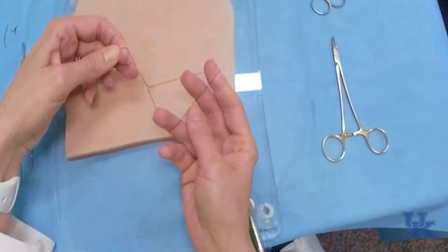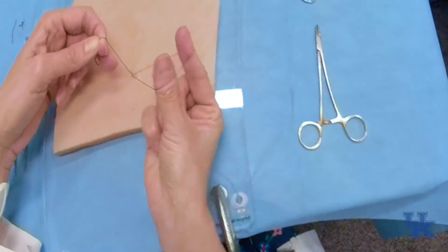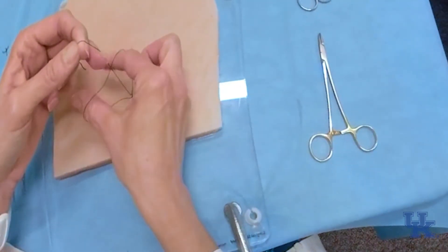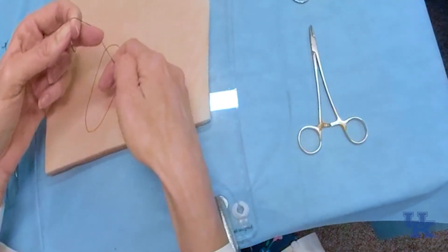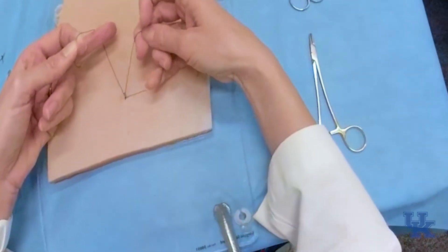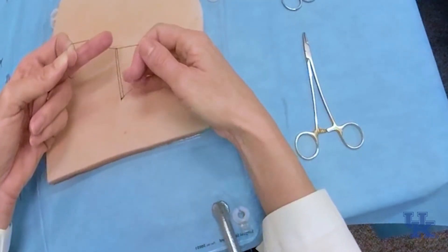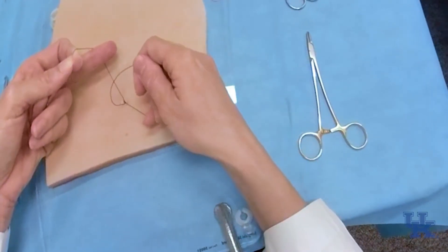So then we can do what we call a French knot. We use two fingers to kind of make a loop here. We're going to grab this suture inside of the loop, and I hold on to the needle. I never let go of this, and I just pull the bottom part of it until it pulls that down. Hold this open. Pull this through there. Pull the bottom until it comes down.